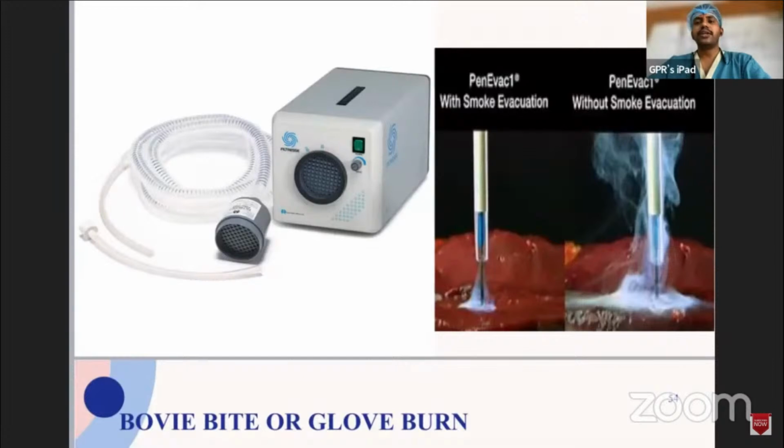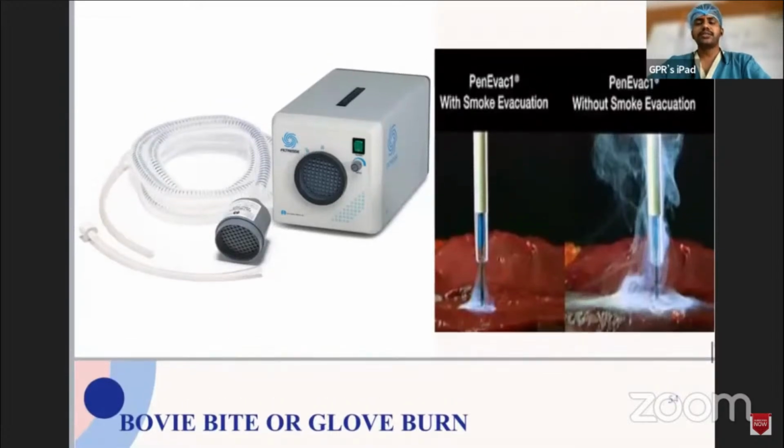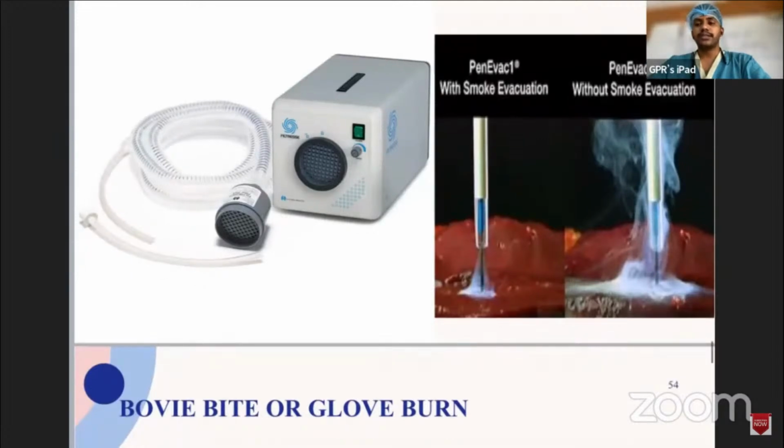In the left corner is the endo evacuator, which is connected to one of the trocars per se, and this will evacuate the harmful and dangerous surgical smoke out of the surgical field. Surgical smoke can initially cause eye irritation, sore throat, lung irritation and emphysema. Later, it can produce carcinoma lung.